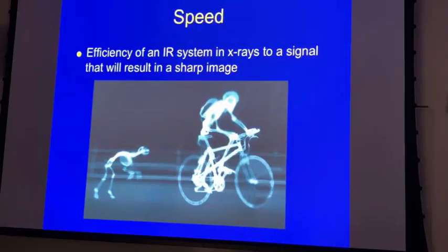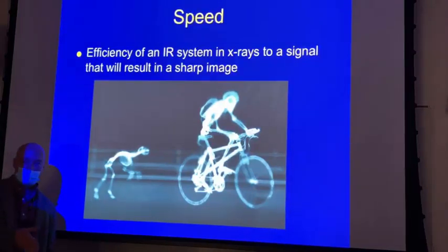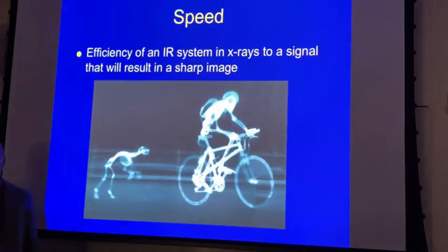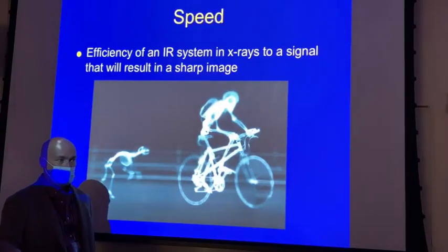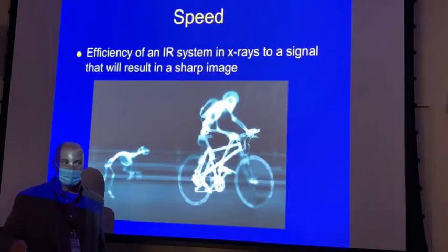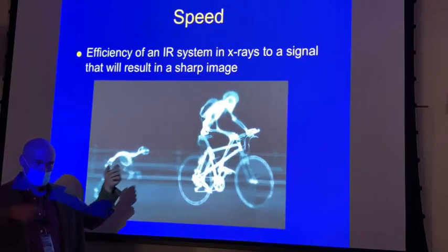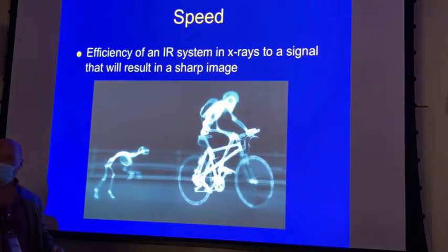What you're going to have a tendency to do on tests is go in the wrong direction, okay? As speed goes up, your mAs goes down. Usually when people make this mistake, they have the numbers right, but they have the direction wrong. If you go from a 100 speed to a 200 speed, that gives you twice the signal. So what do you do with your technique? You reduce your technique by a factor of 2. So if you go from 100 to 400, then you reduce your technique by a factor of 4.